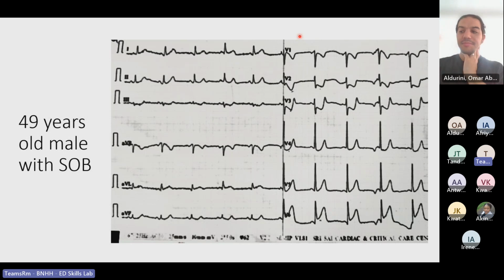Yeah. Okay, if I check the interval of each wave from V1 to V6, they look in the same range for each of the waves. And I think we want to check for the ST depression here, if I'm correct.